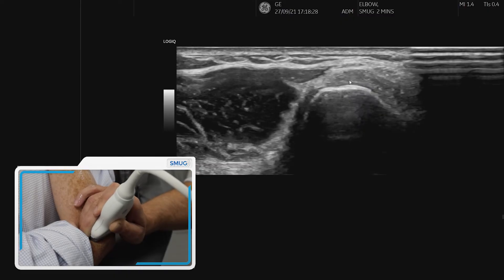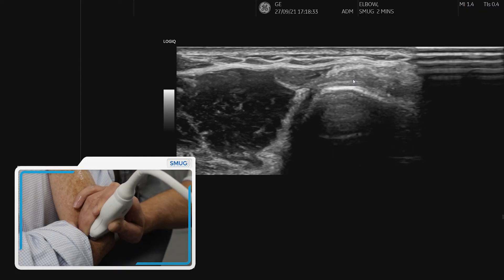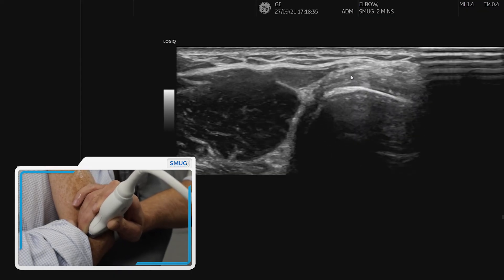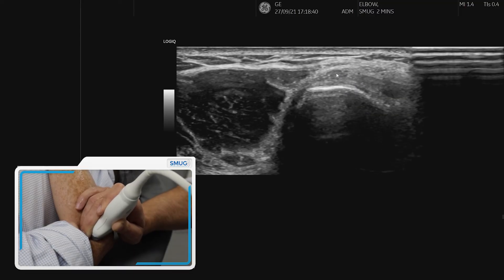And actually, this transverse view can be very helpful, and is also a nice view to use if you're going to do any interventional procedures such as PRP or dry needling, because you can really target that specific tendon.